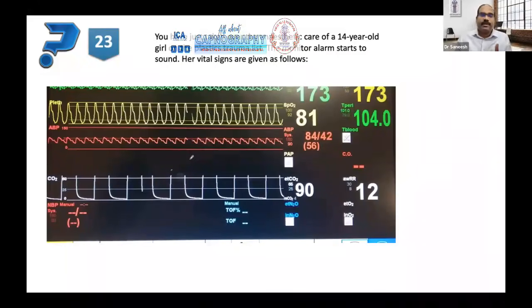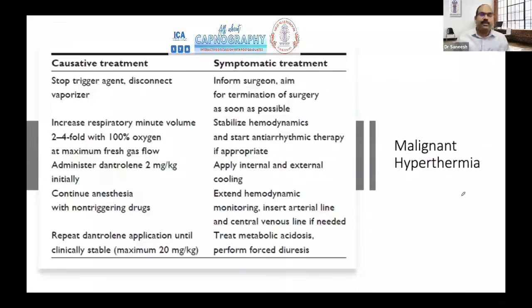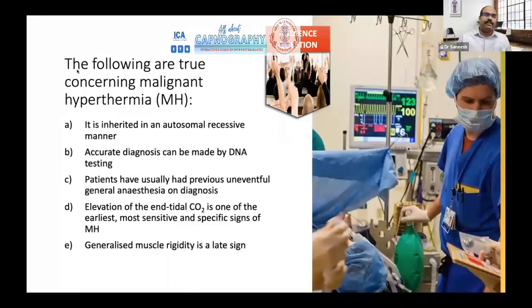So this is, I think, one routine or favorite question in some of the board exams abroad. In India, we don't probably identify malignant hyperpyrexia, but can you mention a similar scenario which we can find more easily in our country? Thyroid storm, probably. Yeah, again you get high sympathetic drive, high EtCO2, and hemodynamic changes. Excellent.